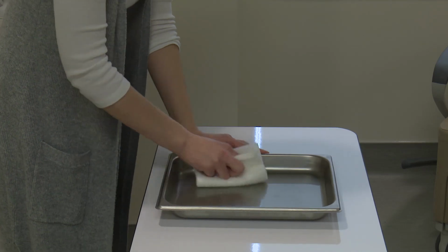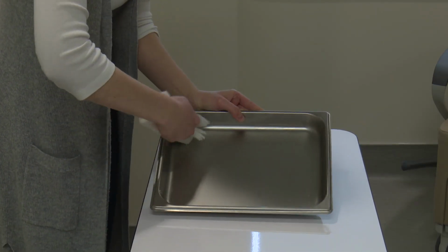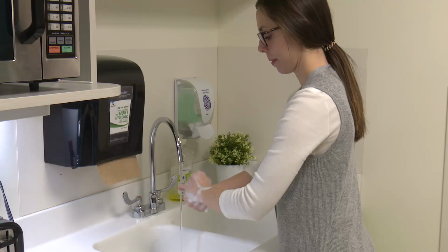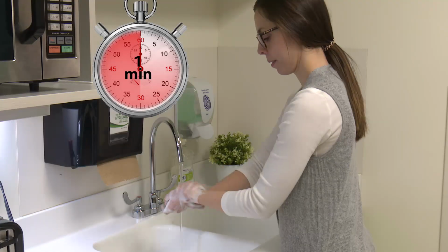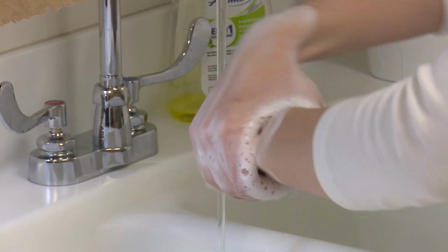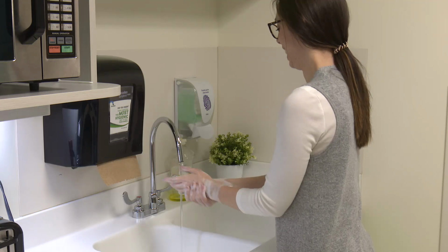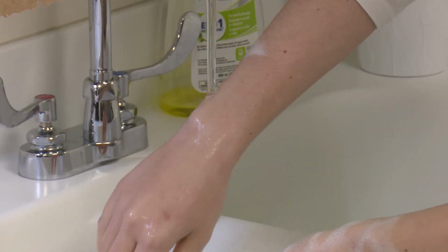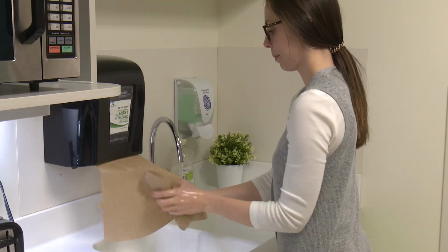Clean the tray or surface you will be using to set up the supplies. Wash your hands using soap and water for 1 minute. Make sure you scrub your hands well and dry them with a clean towel or a clean paper towel.